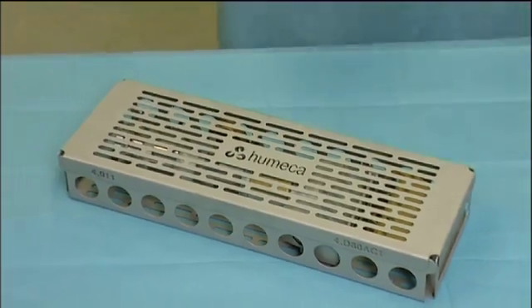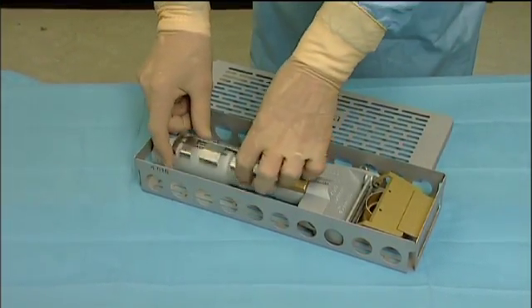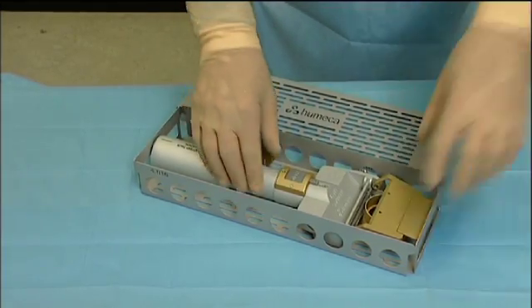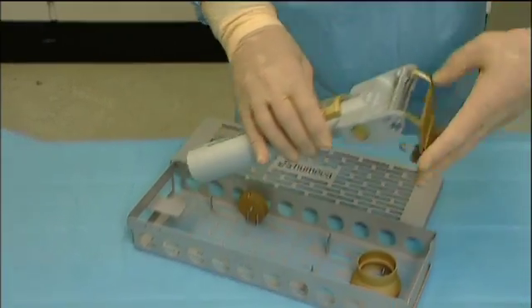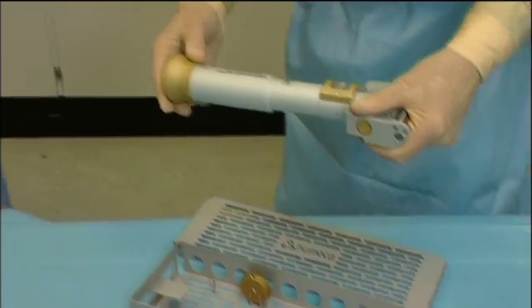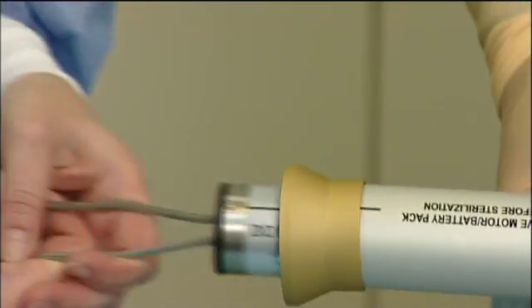Before use, the autoclave case is opened and the dermatome and its accessories are taken out. The blade cover is closed and a sterile funnel is slid over the open end of the shaft. After connecting them, the non-sterile motor and battery are slid into the shaft.